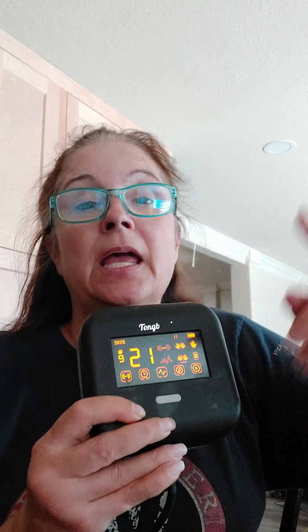And what it does is it has different levels of strength. It's also got a lot of other cool features. But the important thing right here is the strength. And that is because when I first start, I can hardly move at all, right? So I have to set my strength over here back to nothing. And then run that for a little bit. And I don't need to do the whole 21 minutes. Just run it till I can feel it starting to loosen up. And I'll slowly work my way through all of those levels.